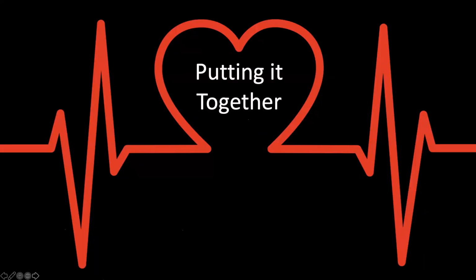But also clinically, it has great impact if you're seeing an ECG and you don't know what it means. It allows you to think about, well, is this coming from the atria? Is this coming from the ventricle? Where is this coming from? It just helps to put that context on it.